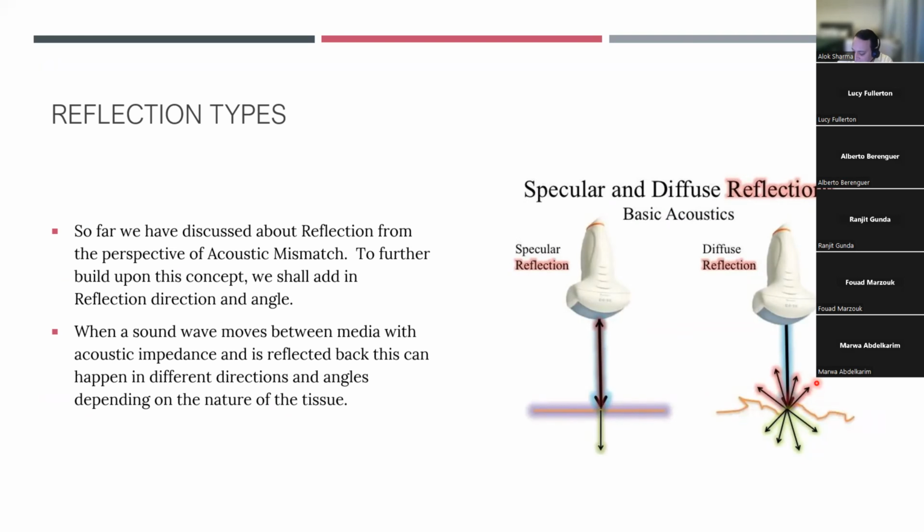So it's the properties of reflection that actually explain why we might have pleural thickening, why we might have irregular pleura. But more importantly, when you look at lung pathology, all lung pathology, as per Daniel Lichtenstein, originates from the pleura. So if you see deeper structures that don't originate from the pleura, then from my perspective, you should be very careful that what you might be seeing is purely artifact, and/or the plane in which you're using the probe might not be accurate. Again, something that we will describe a lot when we do peer review.